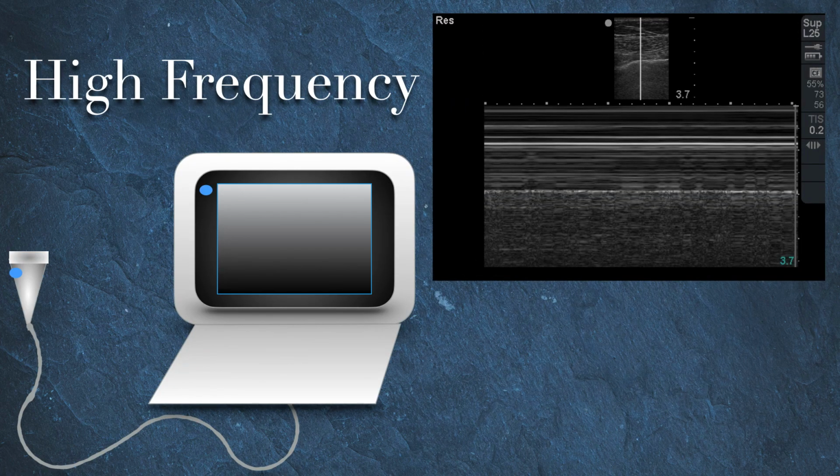This is a high-frequency probe using the linear probe. It is an image which is taken in M mode, which we will discuss further in OB, lung, and echocardiography. You'll also notice that the image is rectangular. Additionally, you can see on the right side of the screen that the depth is only 3.7 centimeters.